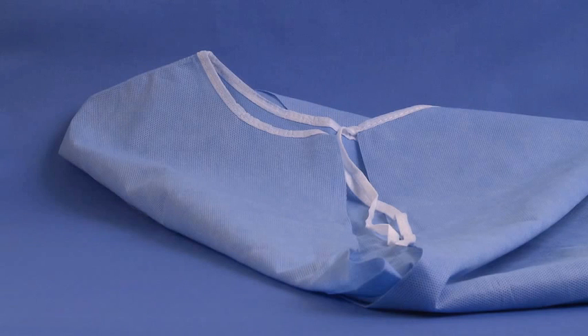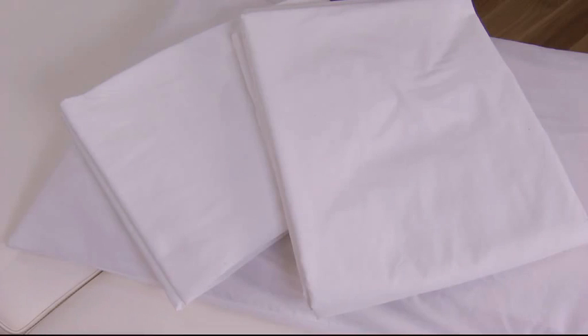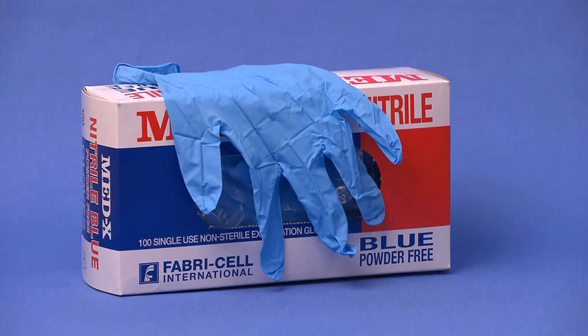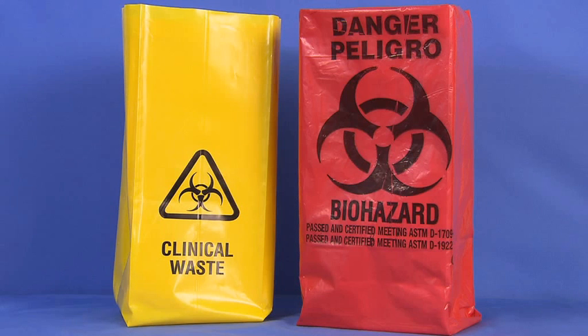Additional equipment includes a patient gown and drape, a bed with linen or examination table with paper, pillows, a razor, a patient medical record, gloves if necessary, and biohazard bags.